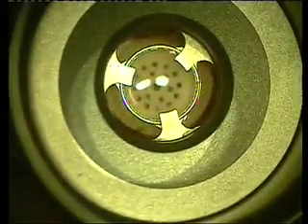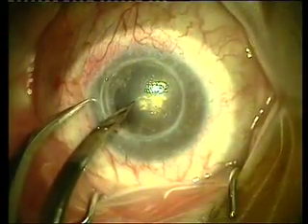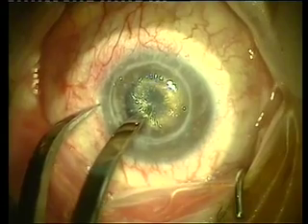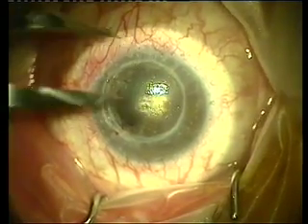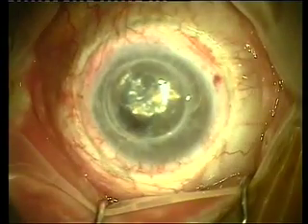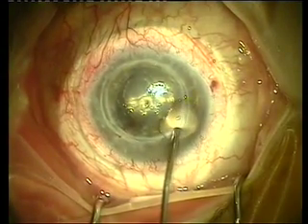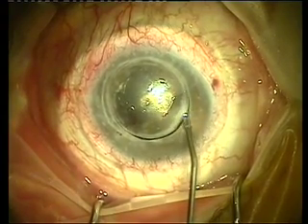We're watching a routine penetrating keratoplasty, trephining the donor cornea with the HANA disposable trephine, going on to a failed graft with an anterior chamber intraocular lens to ascertain the geometric center of the cornea. As you can see here, the previous graft was placed quite eccentrically, and here we're using the host part of the HANA trephine to establish trephination of the patient's cornea.